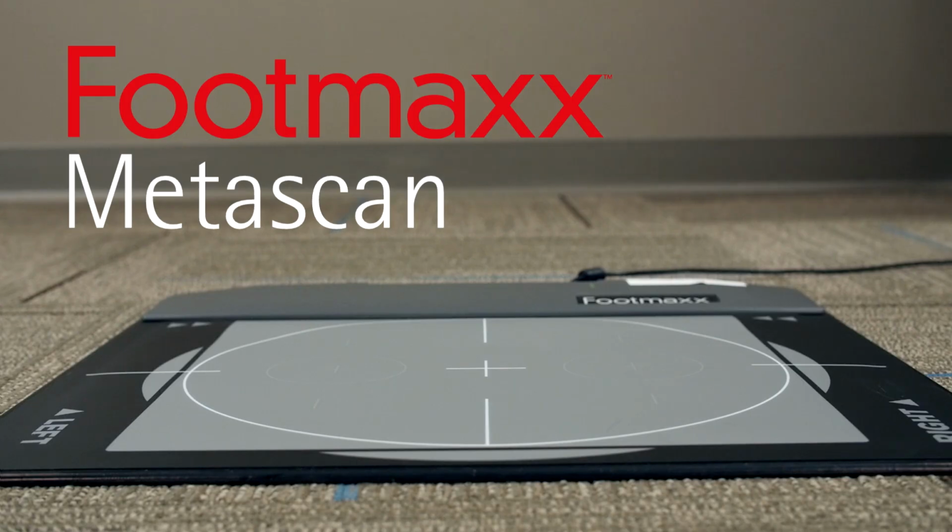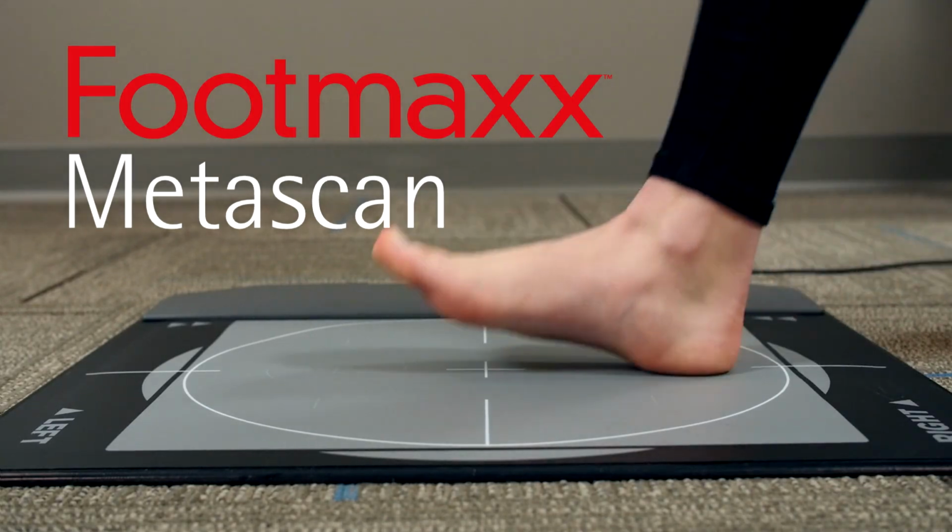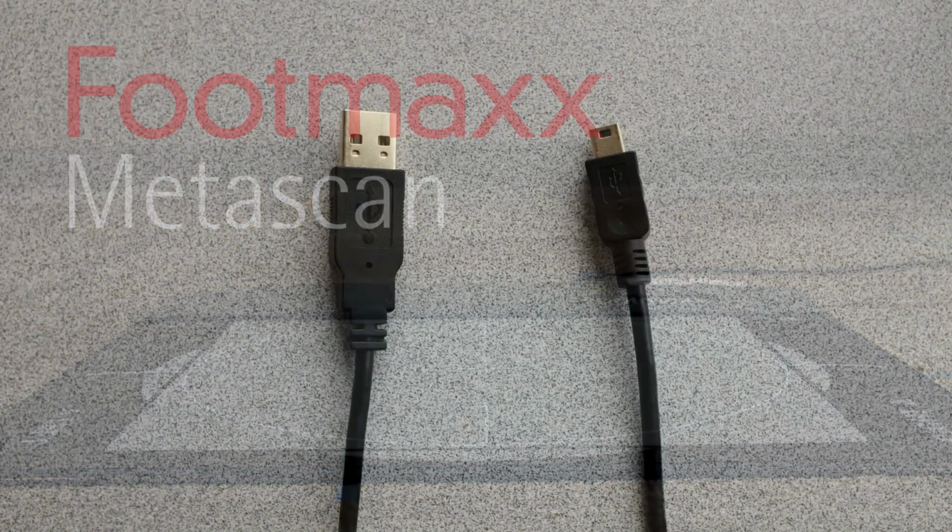Congratulations on your Metascan. Here are instructions for setting up and using your new technology.